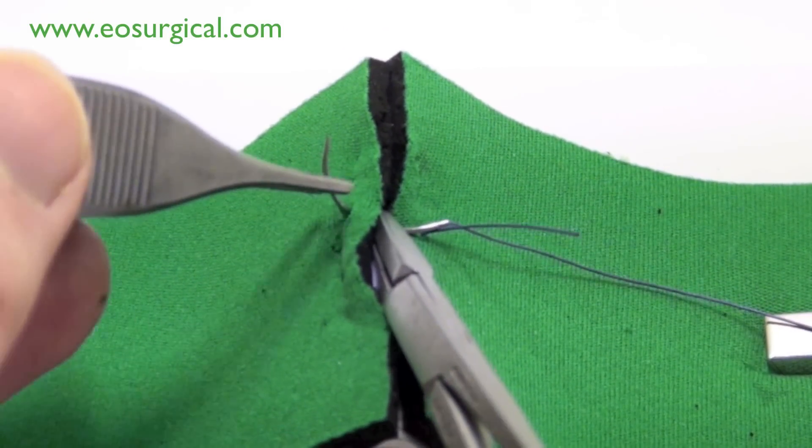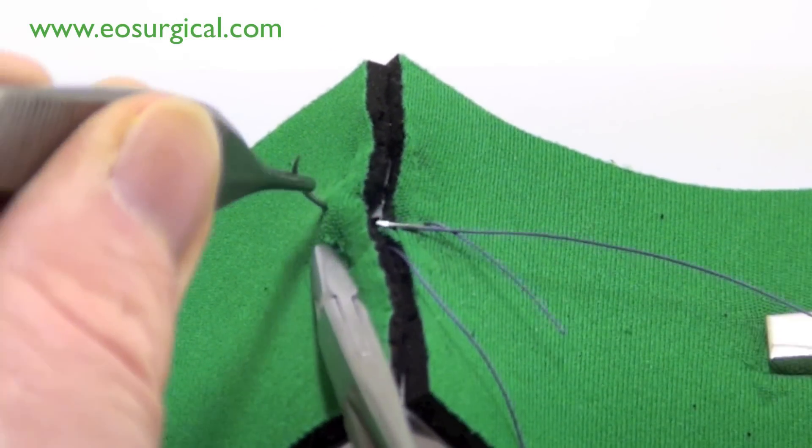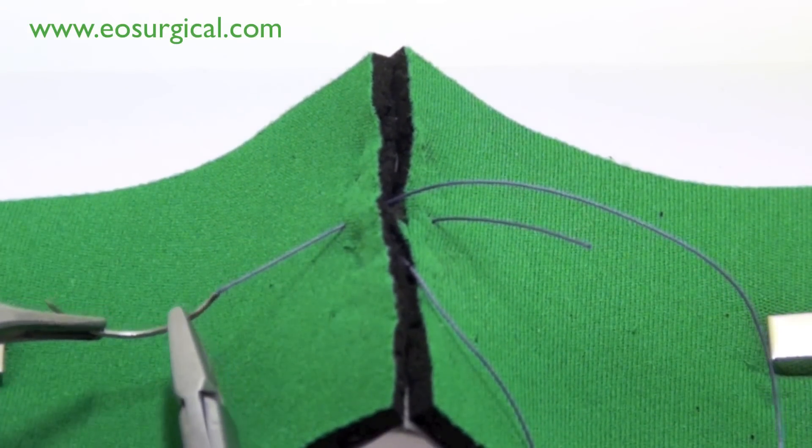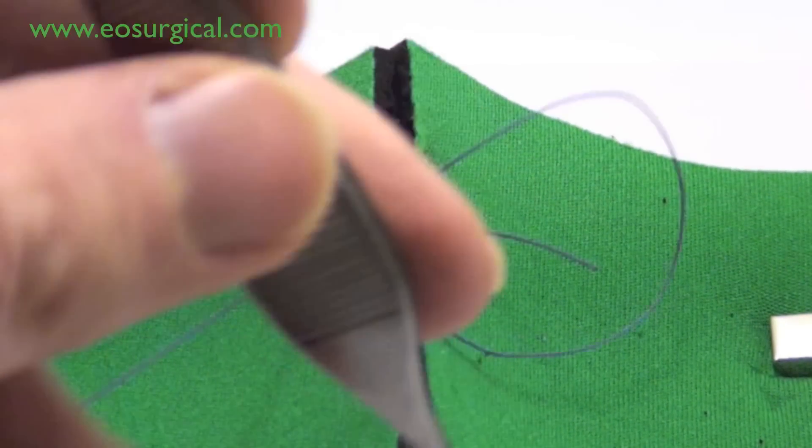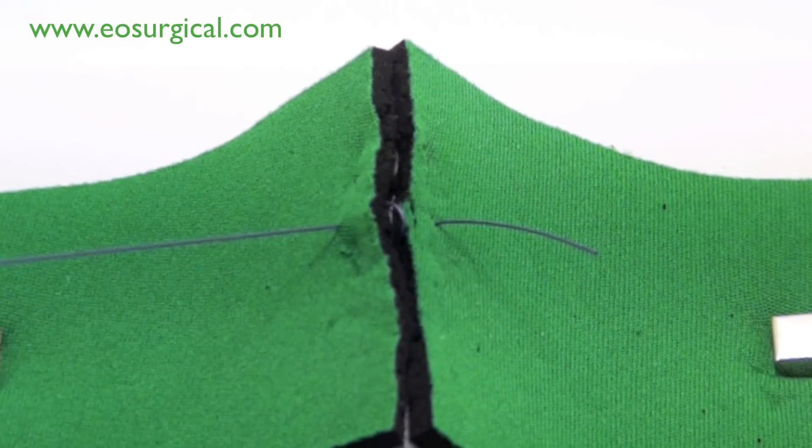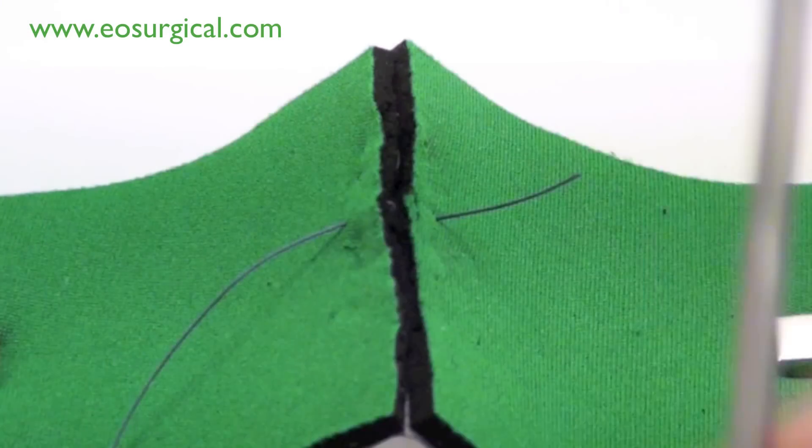This is the exit at point B here. Then it's reversed and re-enters the tissue at point C.